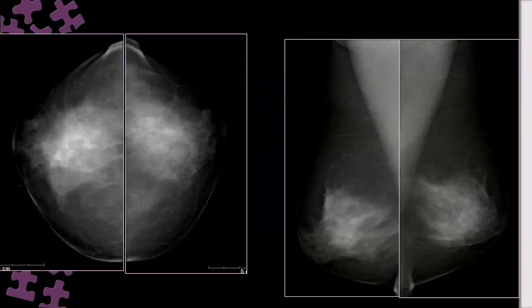Look at this mammography. Can you tell me any abnormality in this mammogram? This is our patient. Area of asymmetry in the right breast, in the center of the right breast. Okay, any other suggestion? Any calcification here? Can you see calcification? Maybe, may or may not. Yeah, maybe. Where? Who said left breast? Huda, excellent. Where in the left breast?